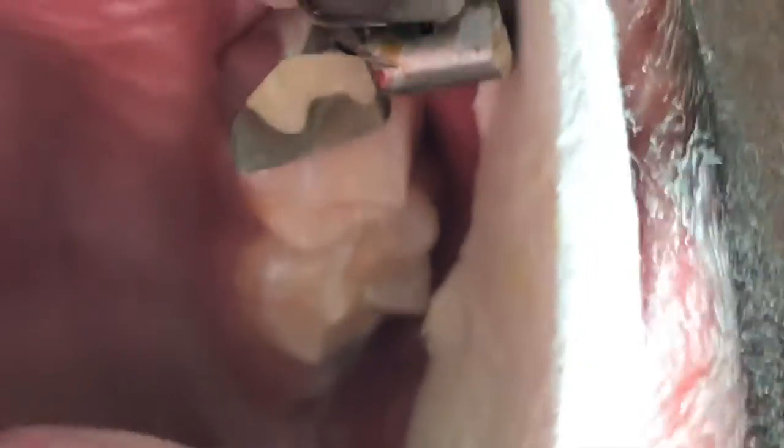So what we do is we tell them, listen, we're not going to do any shots or needles. If anything hurts you, all you have to do is raise your hand, stop. And I'll be honest with you, I can get away with so much. The majority of the thing that bothers them the most is the taste of the bonding agent, which you saw me place a little while ago. That's the only thing they don't like. Some kids will even cry because it tastes so bitter, but that's really the worst part of it.